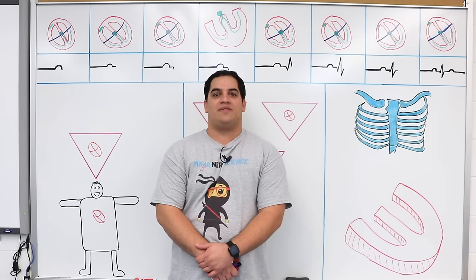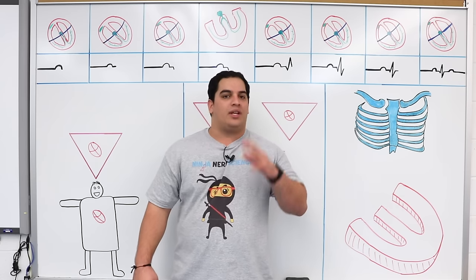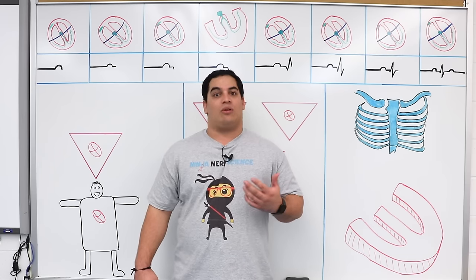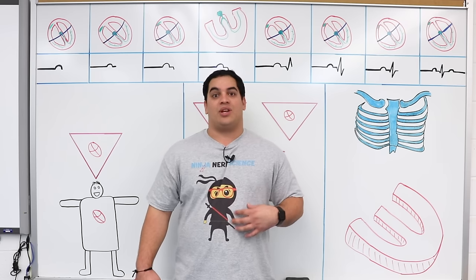All right, engineers, so what we're going to do in this video is talk about the basics of EKG. This is a really important diagnostic tool that we should use as clinicians. It's important for being able to look for arrhythmias, being able to look for possible myocardial infarctions. So it's a great tool that we as clinicians should be able to understand.